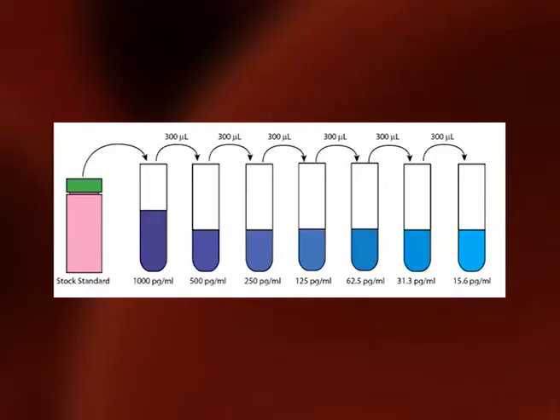Since the antigen is in excess, the unbound antigen binds to the immobilized antibody, preventing the formation of the antibody-antigen-antibody sandwich. The resulting reading appears as a negative result. This artifact is known as the high-dose hook effect. To prevent the high-dose hook effect, a smaller portion of sample can be applied, or the sample can be diluted to reduce the amount of antigen applied.